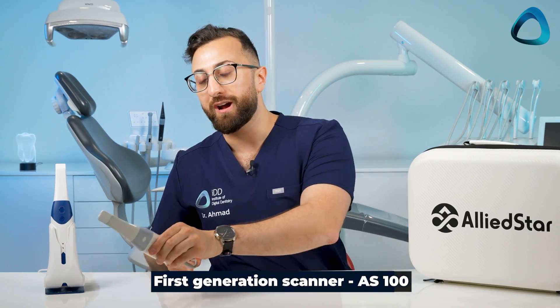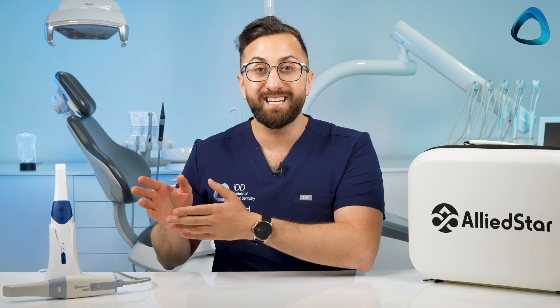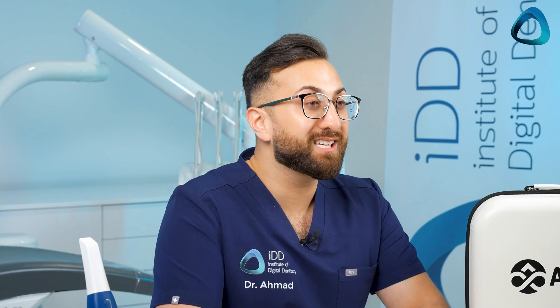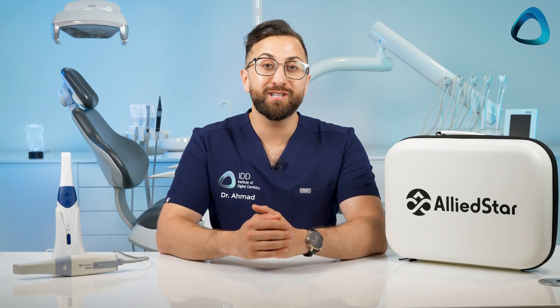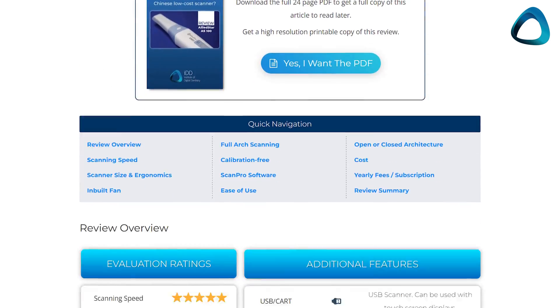Now the AS100 was an interesting product because when I opened the box I probably wasn't expecting too much just because of its quite industrial design, but frankly I was impressed by the performance — especially considering it was one of the first scanners which only needed a USB connection to work. If you're interested, you can see my full review in the caption below or on a button on the screen.